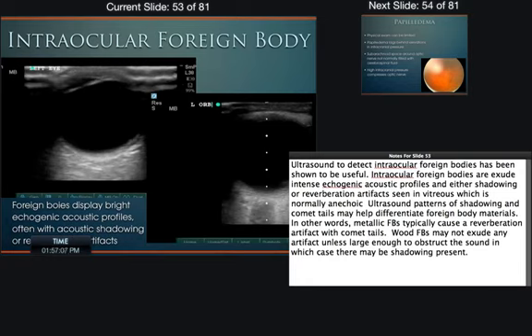So, anyways, this is an intraocular foreign body. We can see it here, and we can see another patient with one that's settled out more posteriorly down here with shadowing. These are both metallic foreign bodies. Something explodes, shrapnel goes everywhere, gets into the eyes, and there are about 200 of those handheld ultrasound machines in Iraq and Afghanistan, and I've trained 2 military fellows now for a year each to go and work there. And they have told me some fantastic stories about shrapnel and intraocular foreign bodies, basically, from some of those blast injuries.